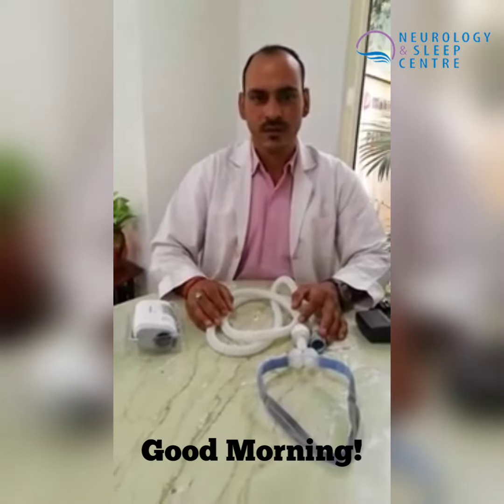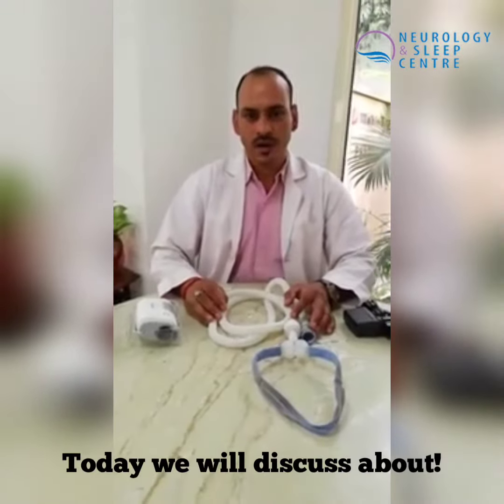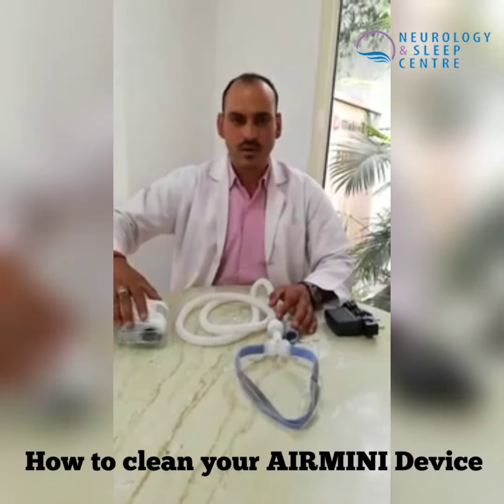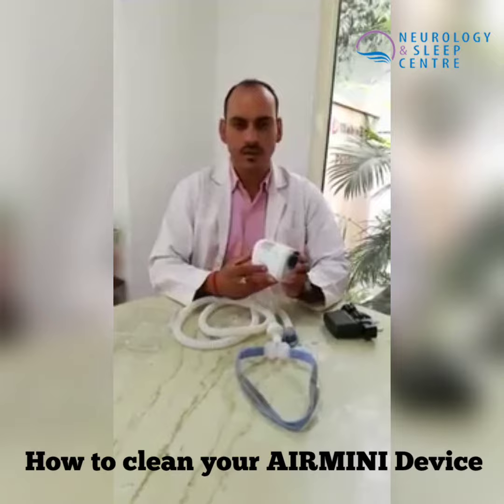Good morning, my name is Anandamani Singh from the Neurology and Sleep Center. Today we are going to make a video about our Air Mini CPAP device user. We are going to tell you about how to clean the device and what is the maintenance of the device.